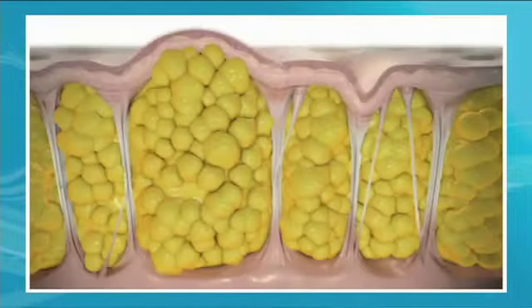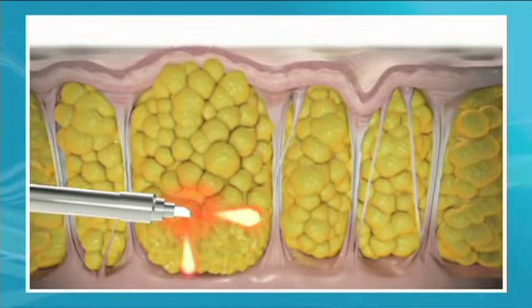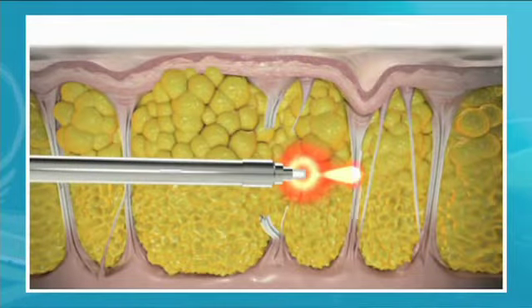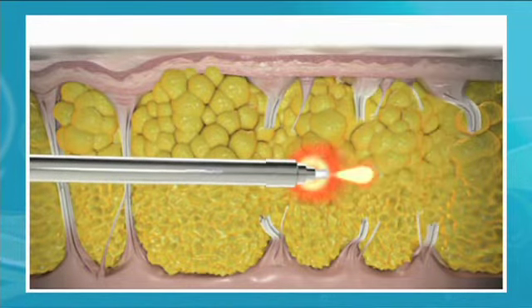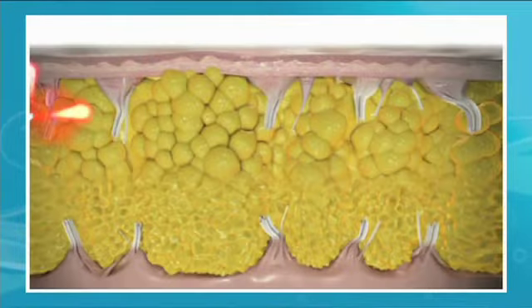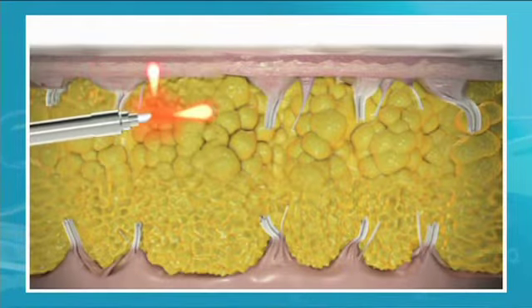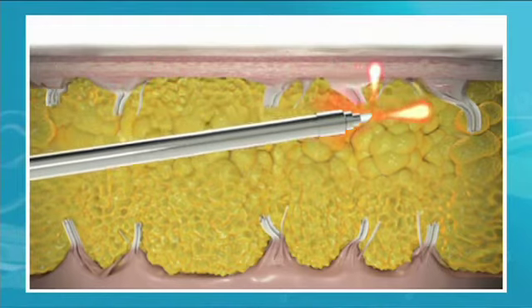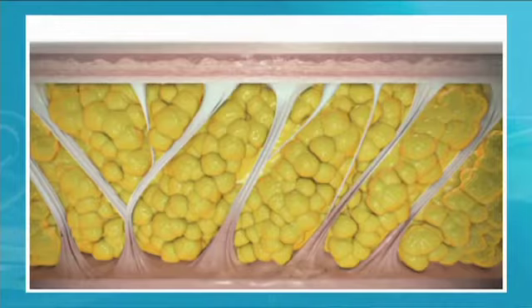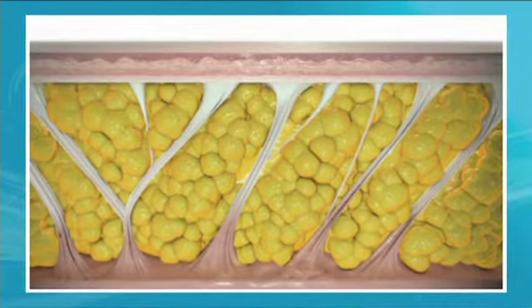Now, because the skin's been stretched alternately and pulled alternately, what you end up with is differences in the thickness of the skin, which contributes to these cobblestoning types of effects. So we'll turn that right angle fiber, again unique, onto the undersurface of the skin, and deliver a certain amount of laser energy by protocol. Once we do that, the skin's going to be stimulated to increase its collagen as well as its elastin formation.